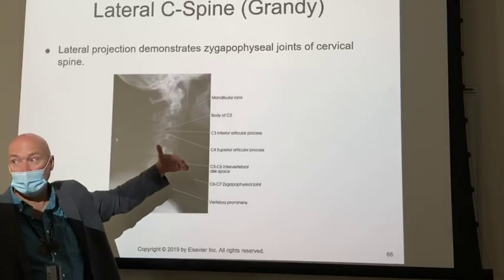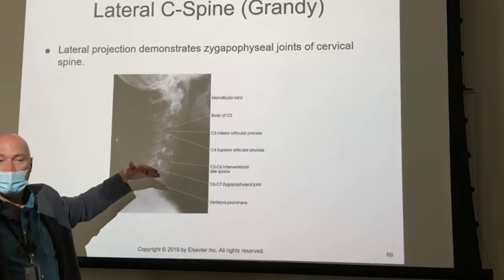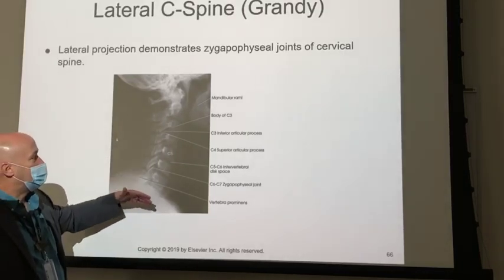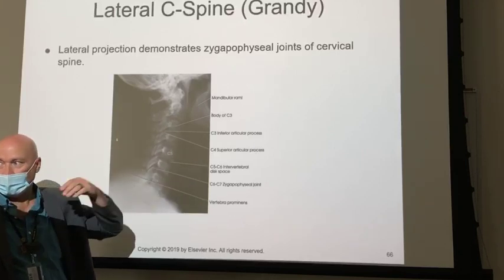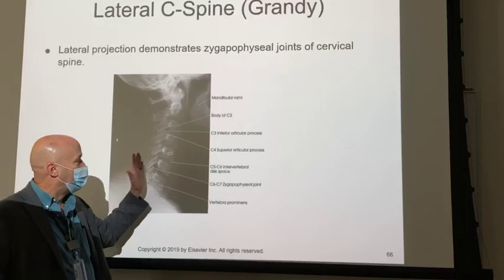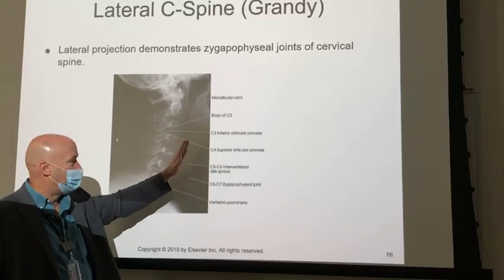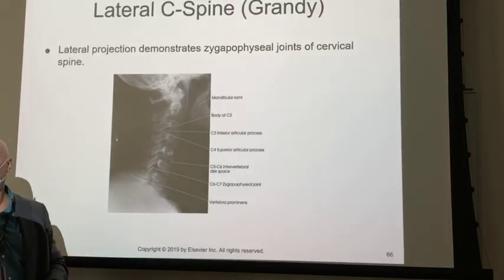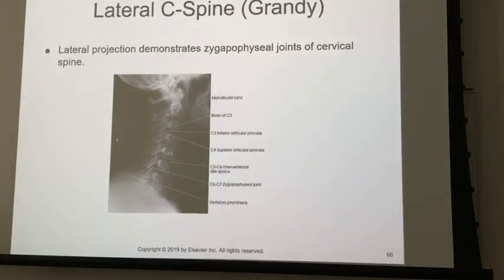So the patient's truly a bobblehead. One of the most dangerous, and probably underrepresented as far as schools go, fractures of the C-spine is your teardrop fracture. Okay, so if you ever happen to see swelling of the prevertebral fat pad, and you see just a funny little fracture, you need to point that out to somebody before the patient moves at all.